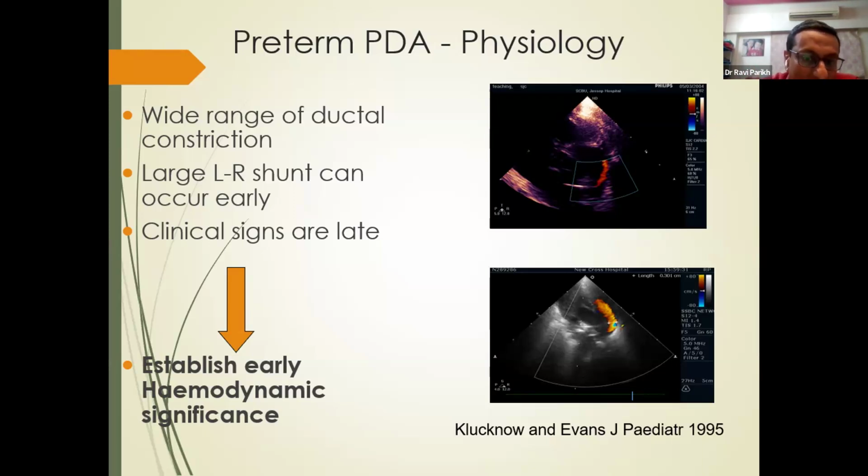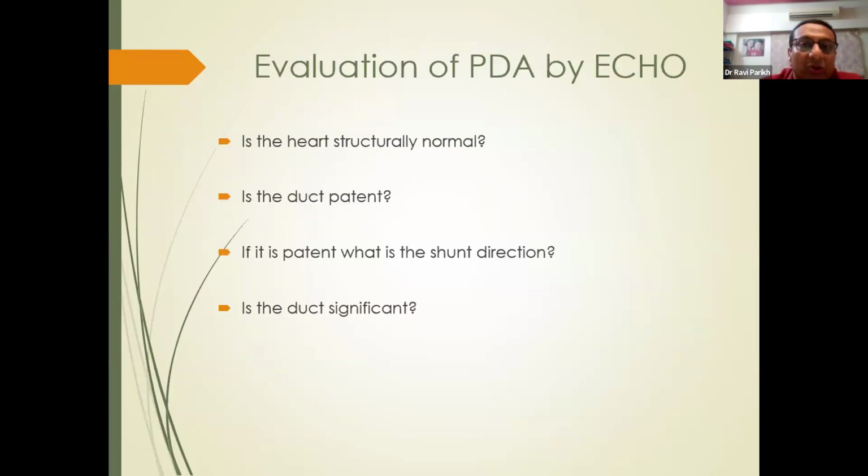And then practically those indices on Friday, all the mentors will show you. So this is very important. Whenever you start to learn echocardiography, even if you just want to see whether the PDA is patent or not, you cannot do a shortcut. You cannot just see a short axis view of PDA, do the echo and then treat the baby.